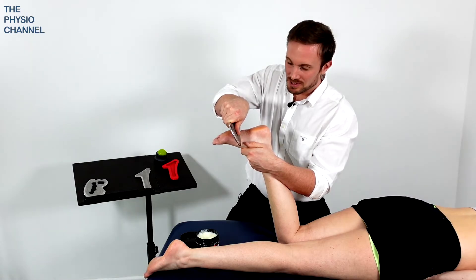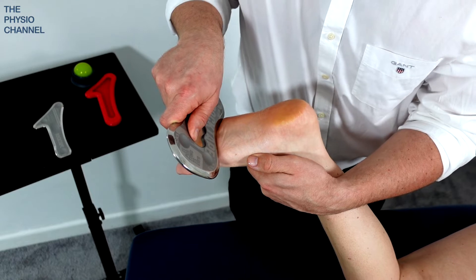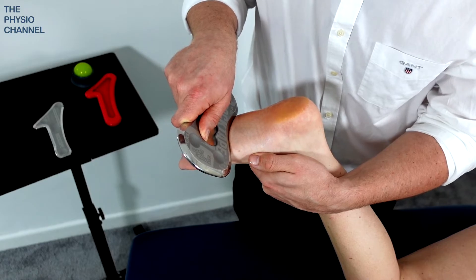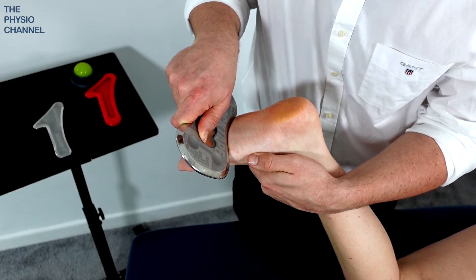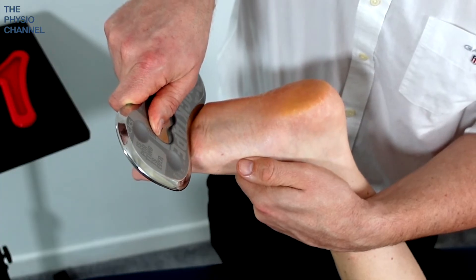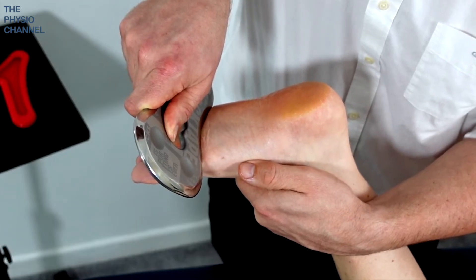Let's get in a little bit closer so you can have a closer look at what we're doing. One of the reasons that we use tools is to save our hands and to reduce fatigue from our work. So what I've done here to help me is lower the patient down so it's a bit easier for me. By bringing the patient closer to me and lower down, it's much easier for me to deliver the treatment and there's not so much pressure on my shoulder or arm.